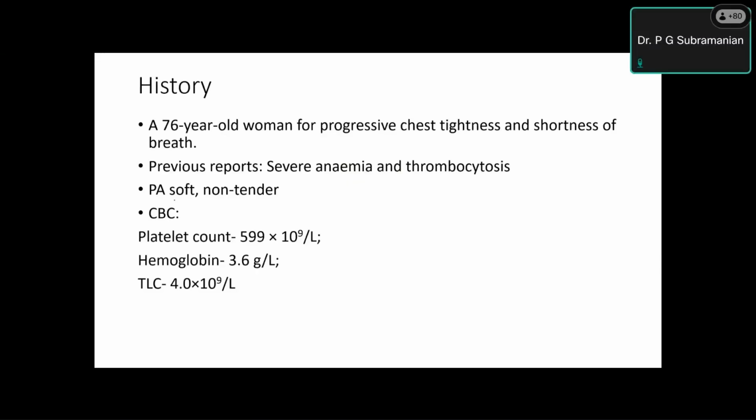For VEXAS, the vacuoles should be there in almost all of the cells, including immature ones. Second, I think the VEXAS mutation is not there here. Also, looking at the bone marrow picture, there was no vacuolation; only peripheral blood monocytes show vacuolation. In VEXAS, you get vacuoles in bone marrow cells, in all lineages and all stages, even some blasts.